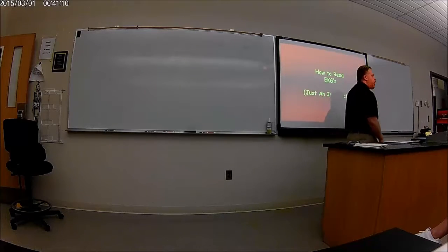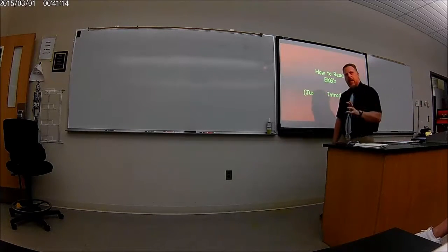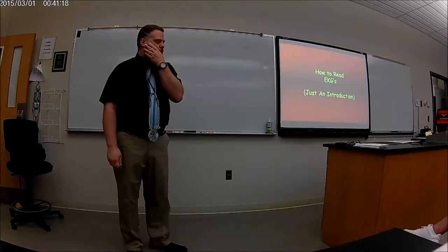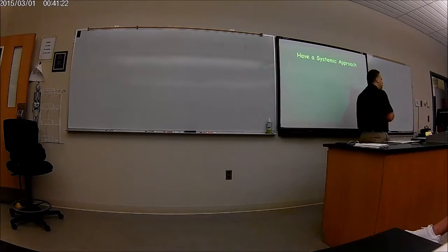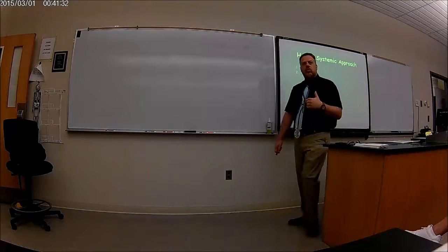All right, so how can you read EKGs? This is just a very schematic thing, but I'm going to show you how you can get some idea how to read this. You have a systemic approach to it. You look at it, what's the heart rate? And I'm going to show you how you can pick out the heart rate over here, okay? See what the rhythm is.